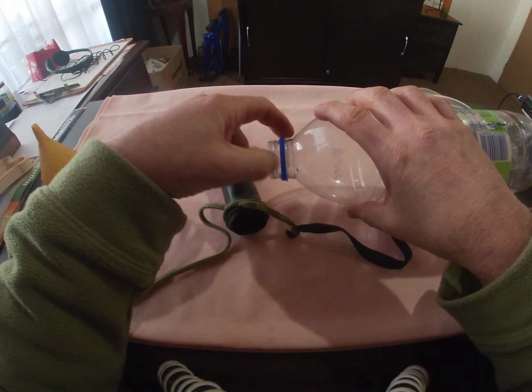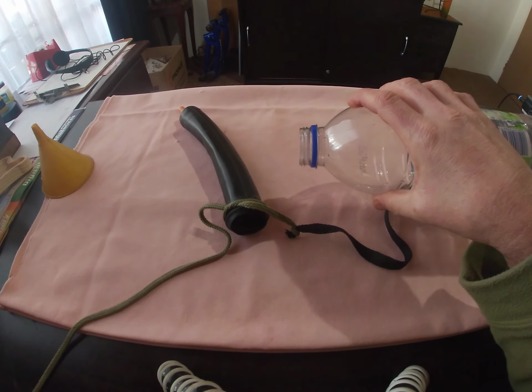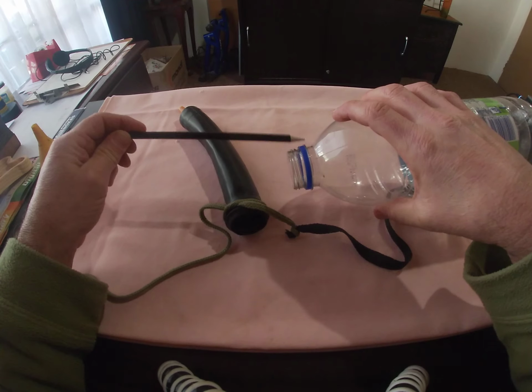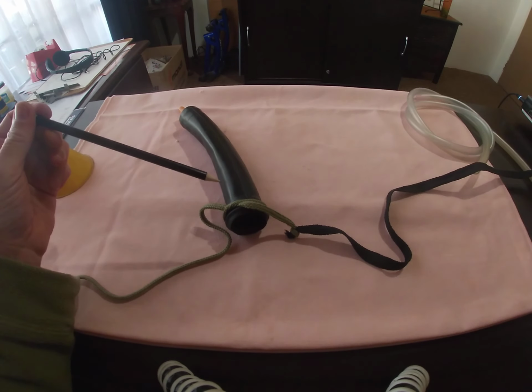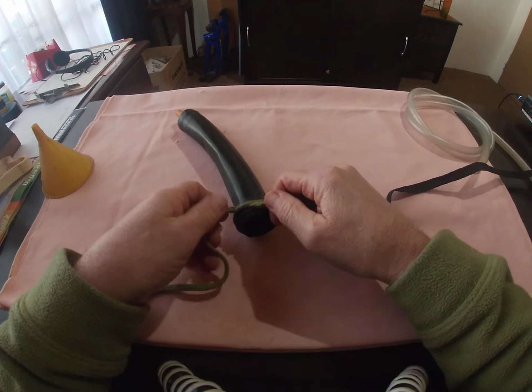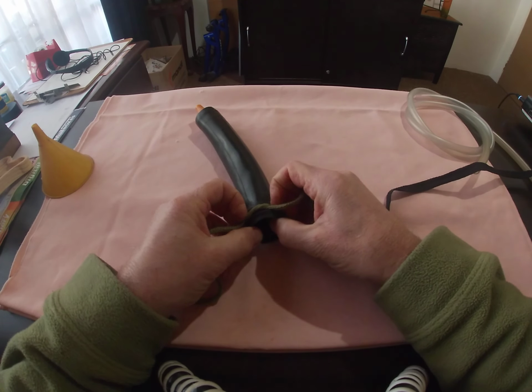Basically, this is the highest part. As you can see, it's the highest part here and here, and that is the part here. So the shoelace will not pull across. I never had that happen to me once. Once it's tight, it will stay there.